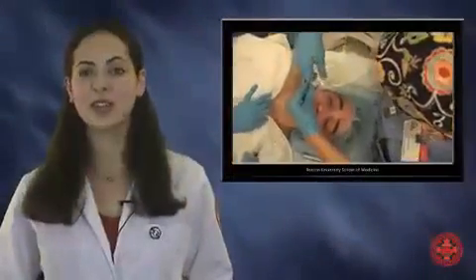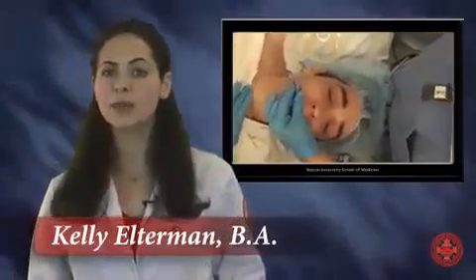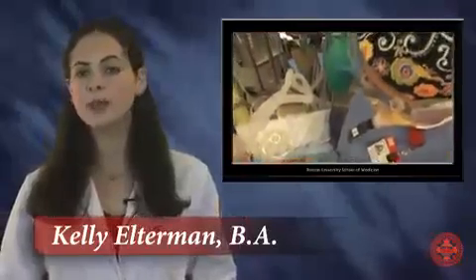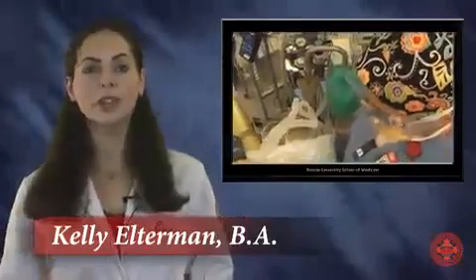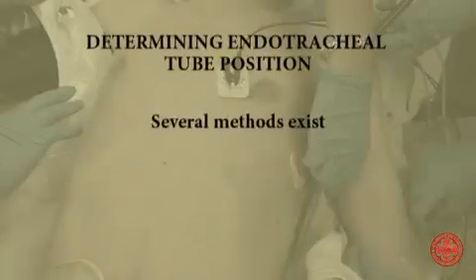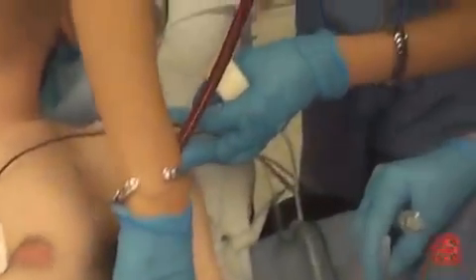After advancing the endotracheal tube, it is crucial to determine its position. Endotracheal tubes can be unintentionally placed into the esophagus or inadvertently advanced beyond the bifurcation of the trachea into a mainstem bronchus. Several methods are commonly used to determine the correct position of the endotracheal tube. However, none is infallible. This is why anesthesiologists insist on combining these methods to assure the highest possible degree of certainty.